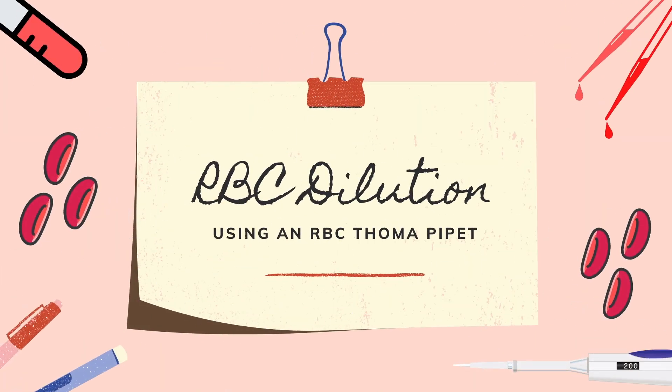Good day everyone! This video will be about RBC dilution using an RBC Thoma pipette.